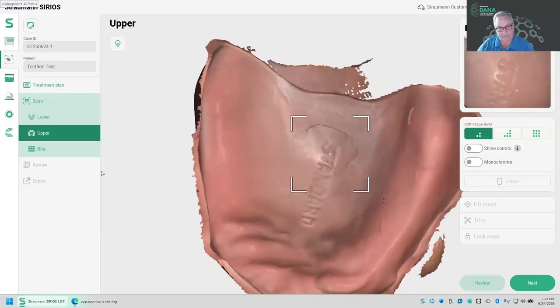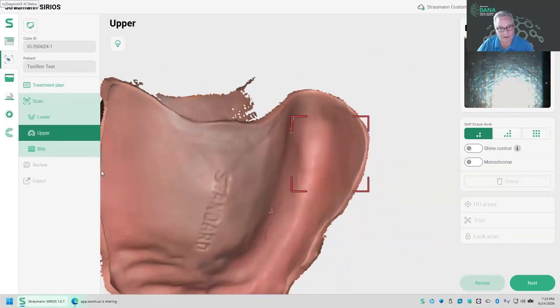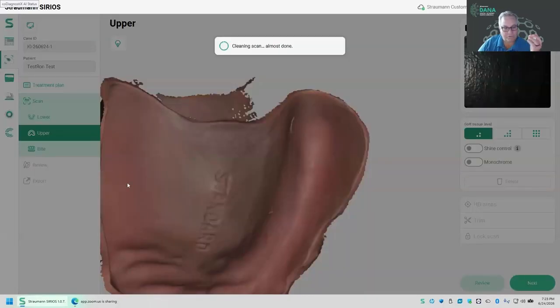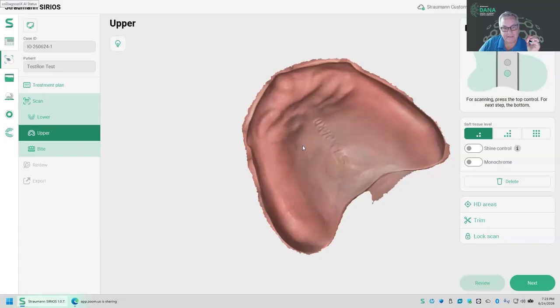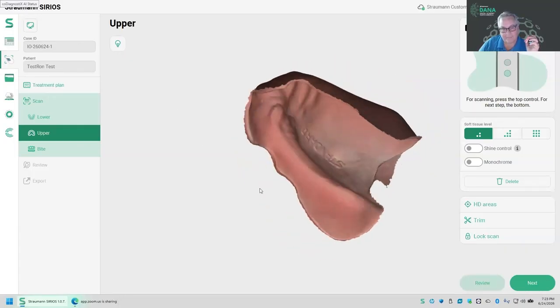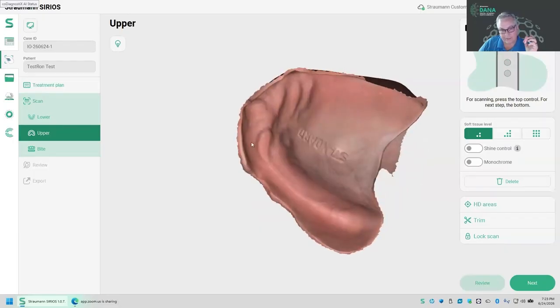And it will redraw that and fix it very nicely. Okay. So there, I have the intact. Let me turn off my scanner momentarily to show you what I have here, let it do its little clean thing. Okay, so this is the inside of the denture. Okay, it sometimes looks like it's coming at you, but it is actually going in to the denture here.